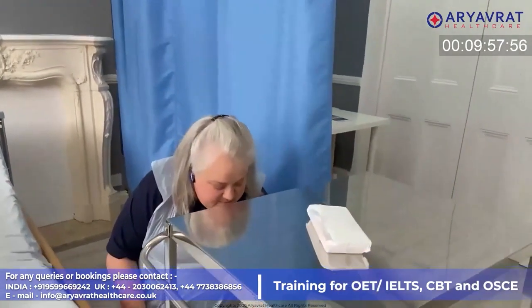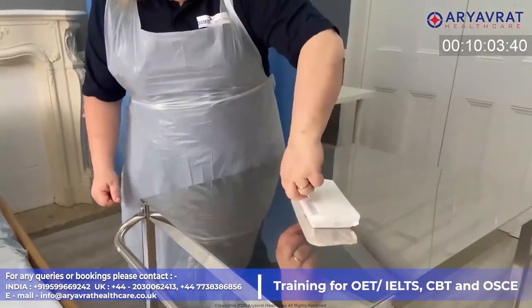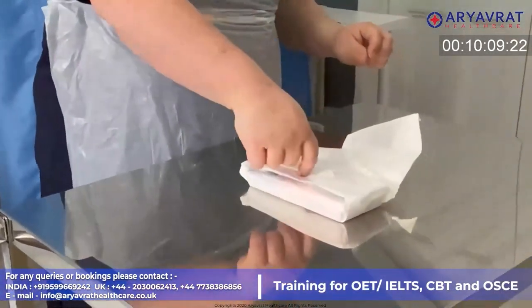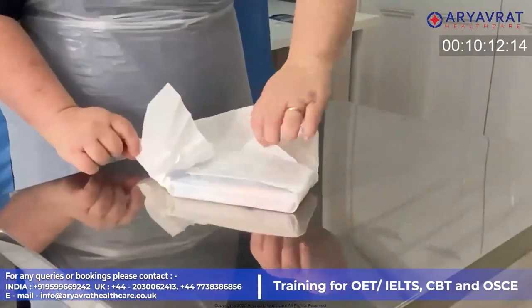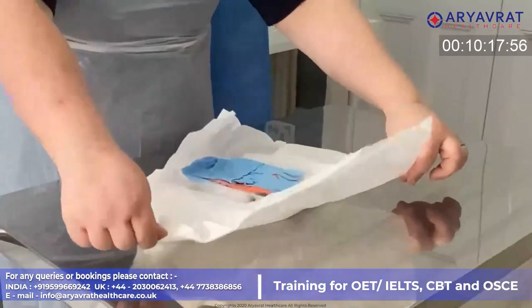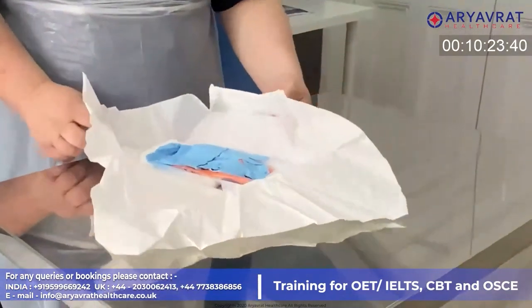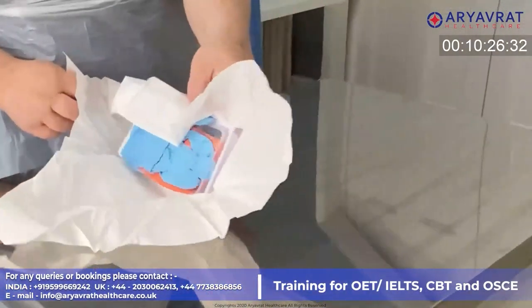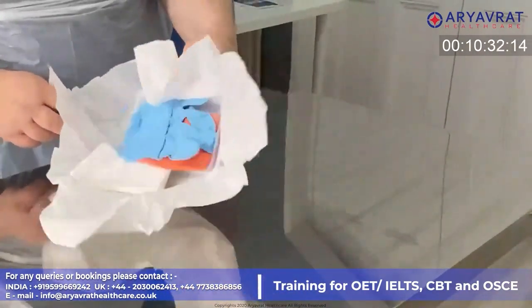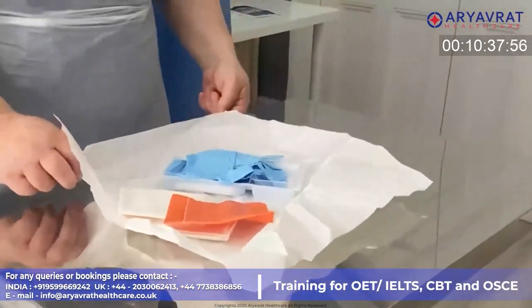What have I got left under here? I am going to open my sterile field, touching the outside of the packaging only. Now, as I want access to this bag, I am going to gently, if I can, without contaminating the area. That's what I want. Okay, so I have got this sterile bag.